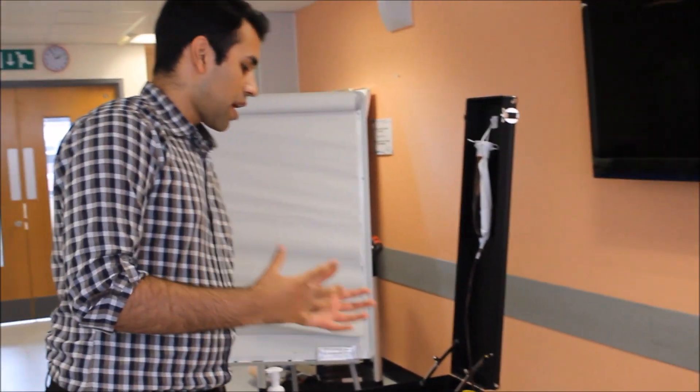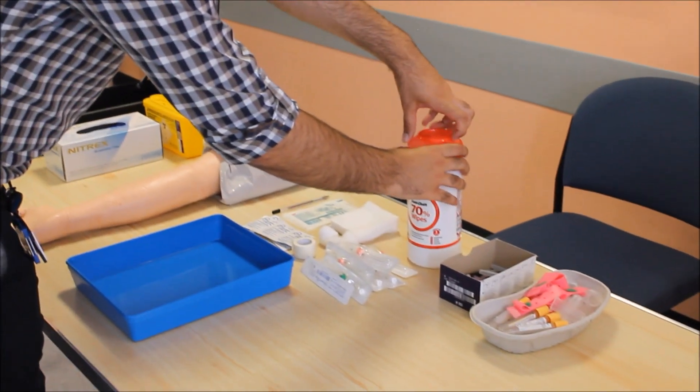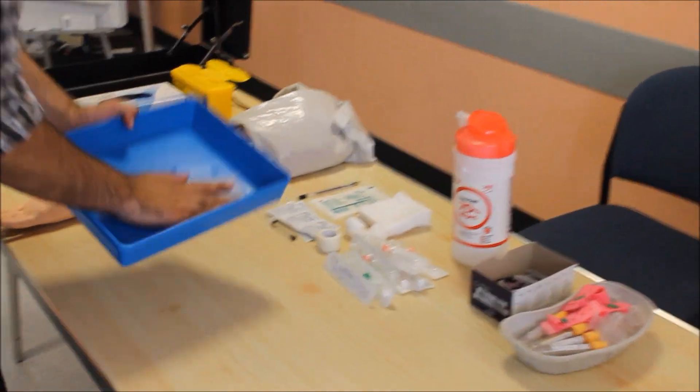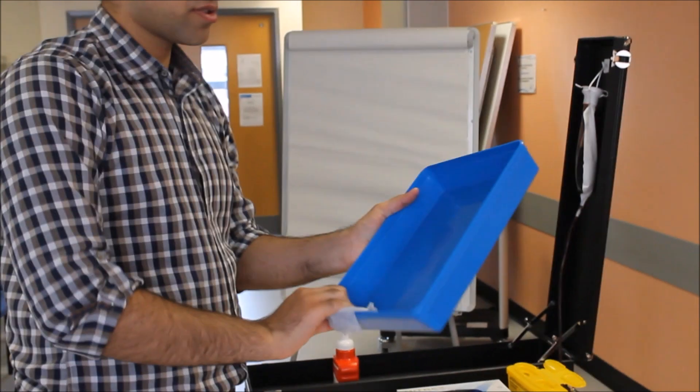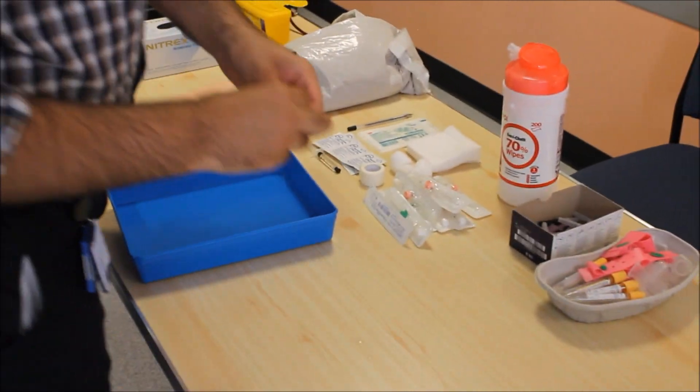After that, I will prepare my clean tray. First of all, I will clean my tray. Make sure to go into the crevices of the tray to clean it up, and then I will throw it away in the clinical waste bin.